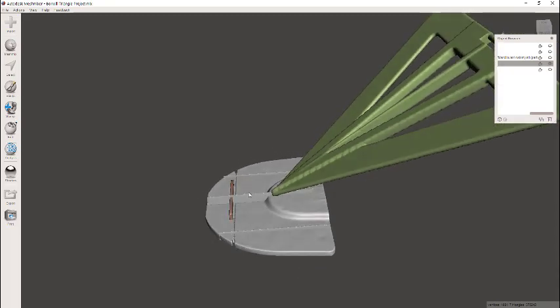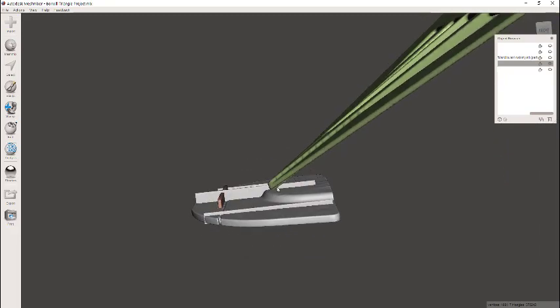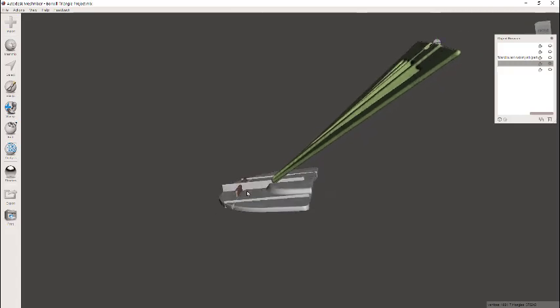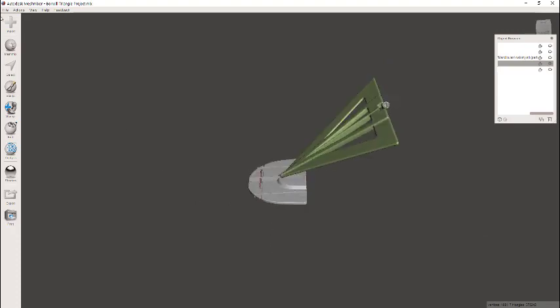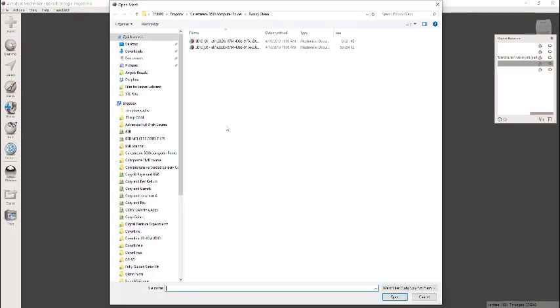If you align it just like you would on the Panadent, you're going to have a slightly longer arcing motion. If you align it truly to the Bonwill triangle and put the incisors of the lower right here, it's going to have a slightly less arcing motion, but both of them are going to be very similar and much closer to accurate than you'll be able to do just arbitrarily moving this around. So what I'm going to do here is I'm going to just bring in a couple of models and assume that I want to adjust the VDO on these two models.